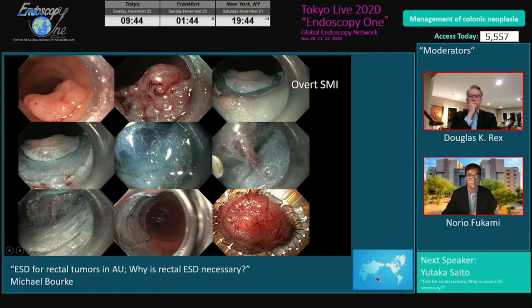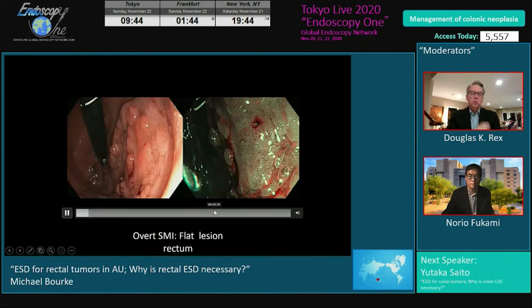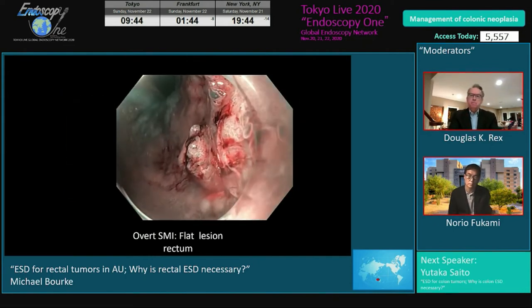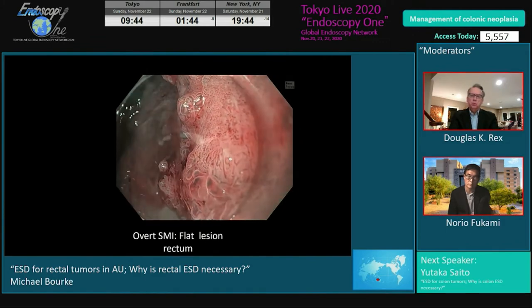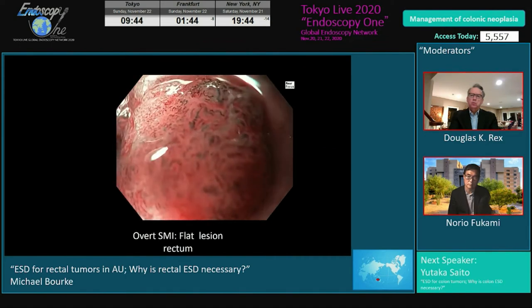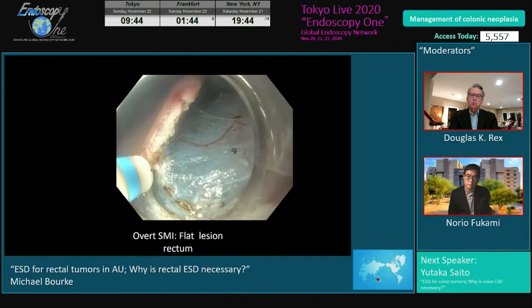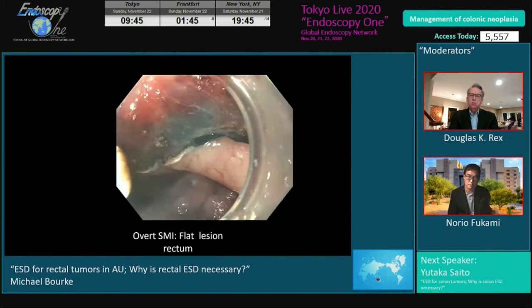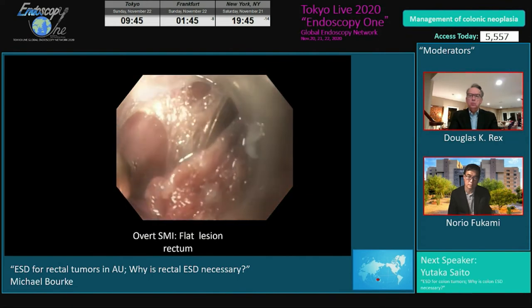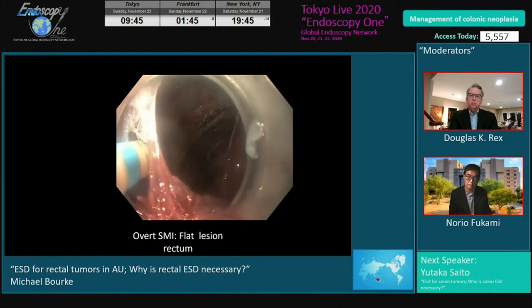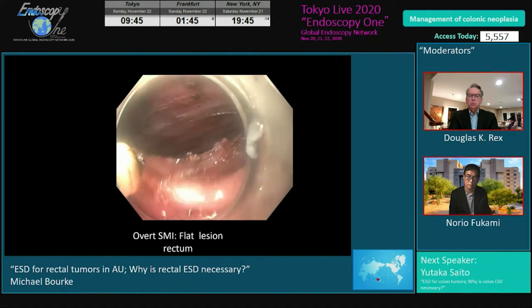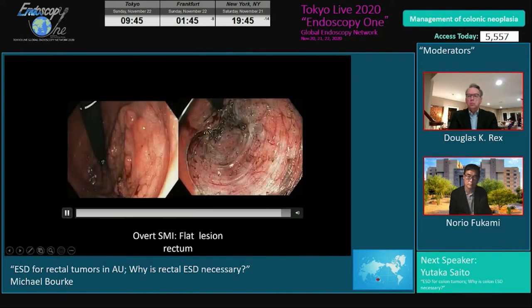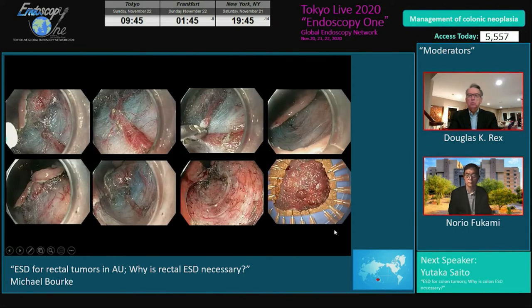We've been doing ESD for about five to seven years; we've been doing upper GI ESD for best part of 12 years. It's easier to learn in the stomach and esophagus than the rectum, because the rectum is very vascular. Here's a beautiful example of a young man with early cancer in a large flat lateral spreading lesion — you see disruption to the pit pattern and microvascular pattern, a demarcated zone. We changed to ESD. We do our rectal cases on Thursday morning, two cases, so we can switch if needed.